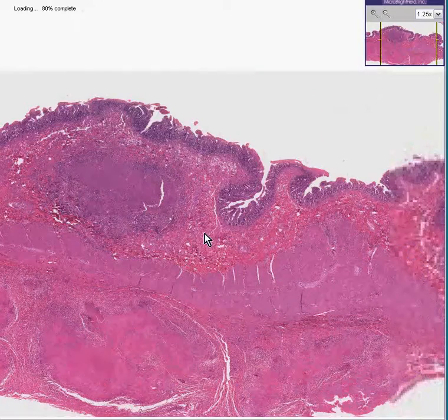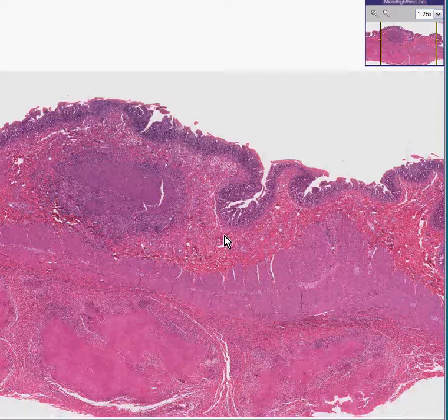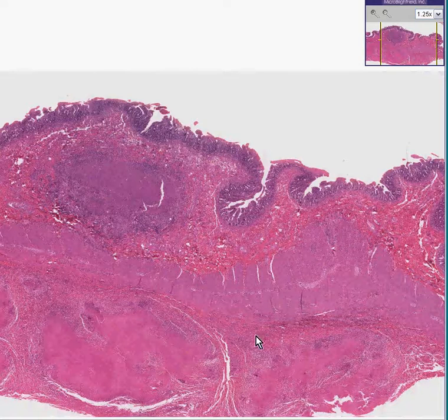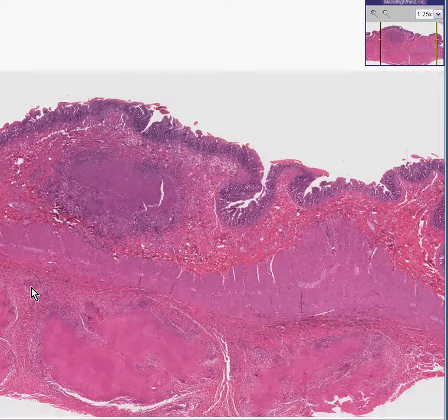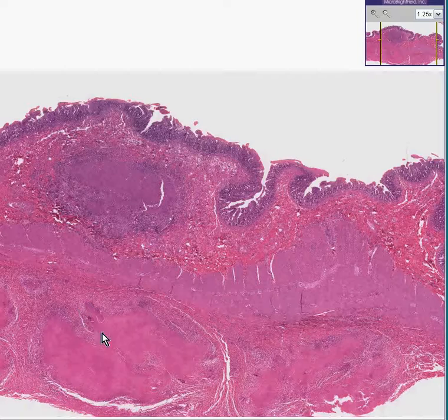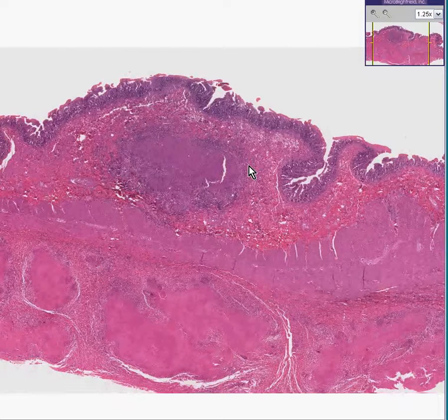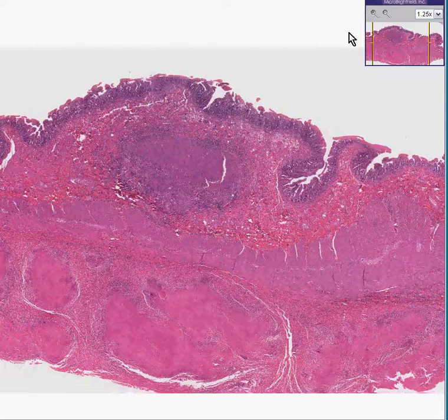The first thing you must notice almost instantly — maybe even before you recognize this as a GI organ — is that you have these nodules here, in here, in here. Some are in the submucosa and some are in the serosa. Some are big with really large red centers, and some are small. So already you're thinking: what are these nodules?